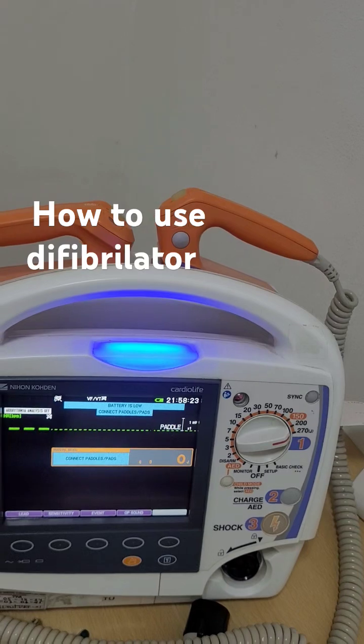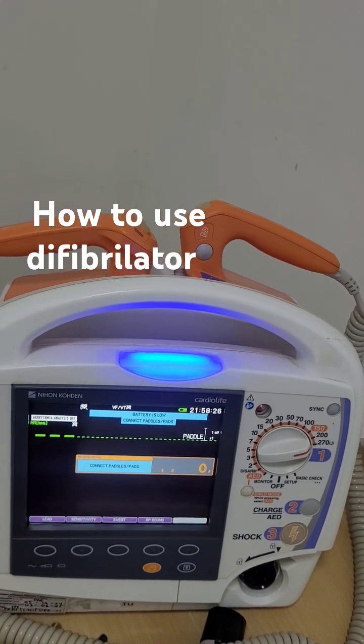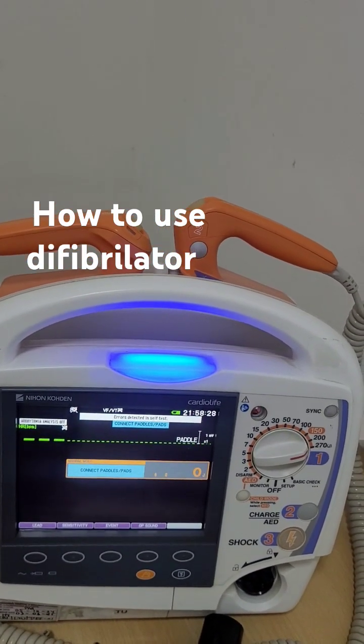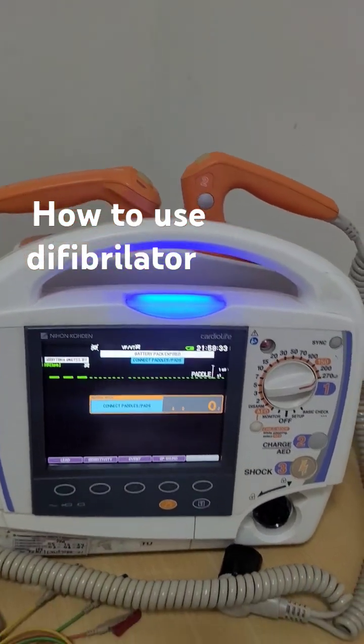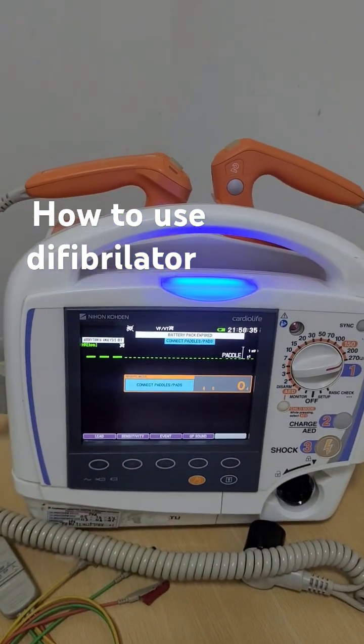That is why you always press the sync button when the patient is alive - for a hemodynamically unstable patient you need to cardiovert, or for a chronic AF patient after anticoagulation when you are cardioverting. That's all, thank you.